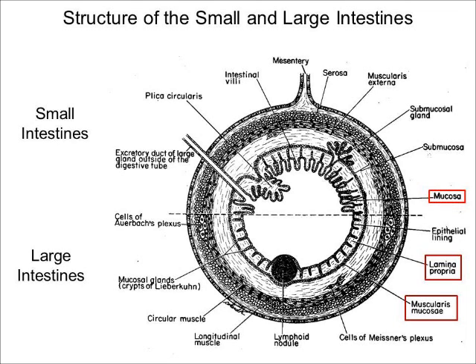It contains blood vessels, smooth muscle cells, fibroblasts, and cells of the immune system. The final component of the mucosa is the lining epithelium that is composed of simple columnar cells and contains numerous mucous goblet cells, which I will describe further in a minute. Please note that while the surface of the colon is flat, it does contain numerous gland-like structures called the crypts of Lieberkühn.